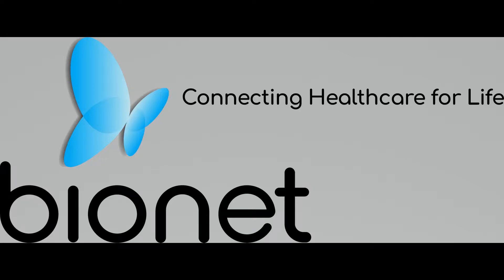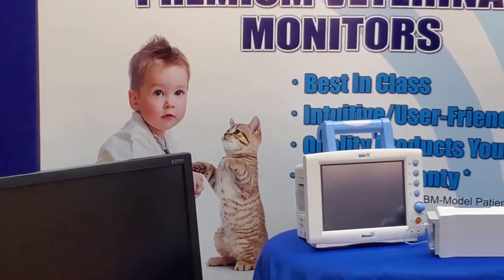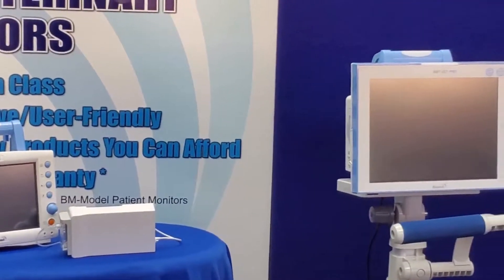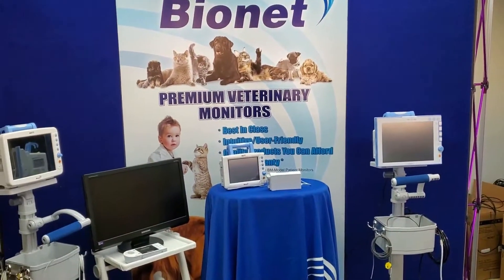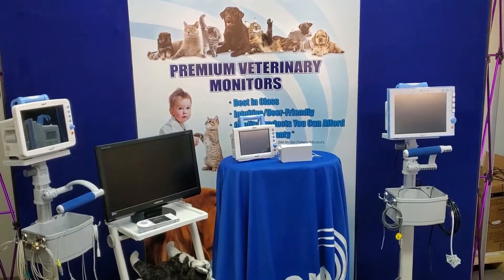The BMVet Pro is the latest line of veterinary monitors from Bionet. These monitors represent the latest in Bionet's unending dedication to innovation and quality care for your patients. You may be familiar with our previous BM Series patient monitors, but let's get to know what comes with your BMVet Pro Series monitor and what's new with the Pro models.